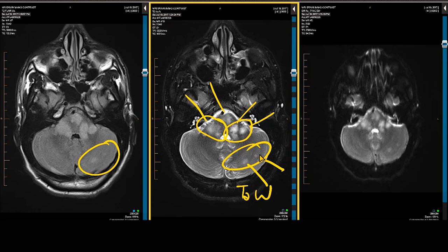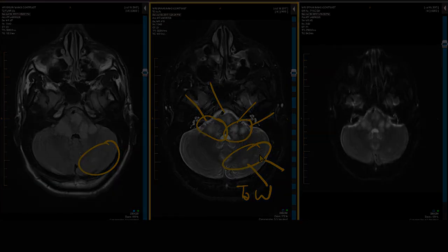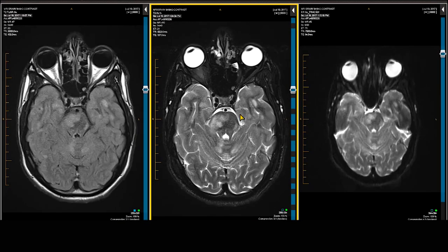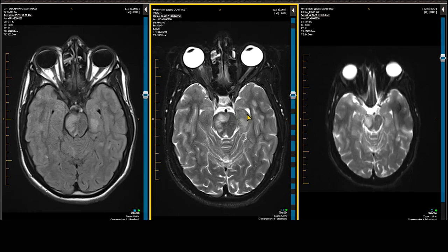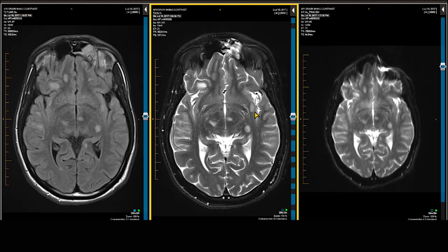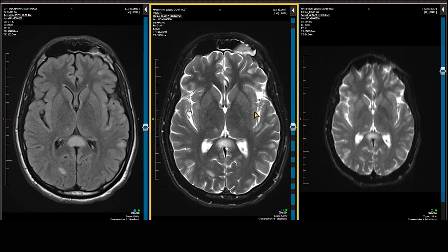These are the demyelinating plaques in the brainstem as well as in the cerebellum. As we course more superiorly, we see diffuse involvement of the left side of the brainstem and midbrain. Now as we enter the supratentorial space, my eyes shift more to the FLAIR imaging because it tends to show demyelinating plaques better — CSF on T2-weighted scan is the same signal intensity as the demyelinating plaques.